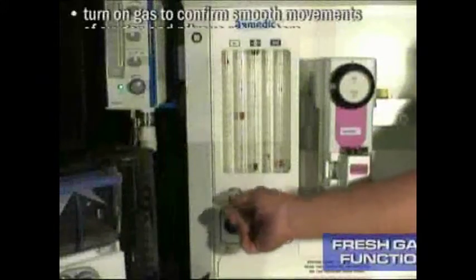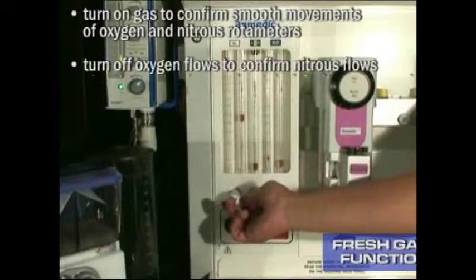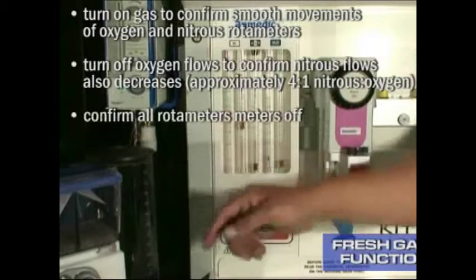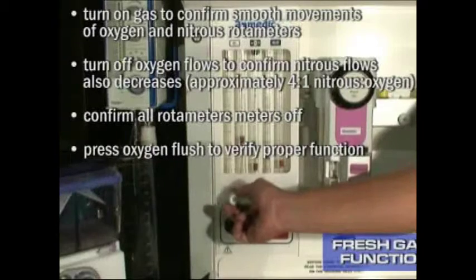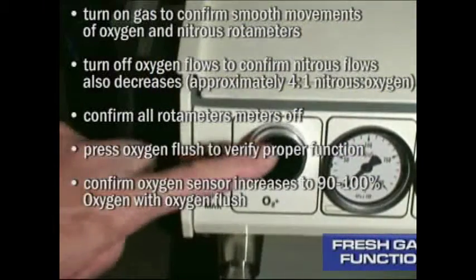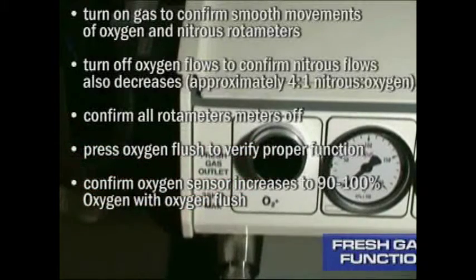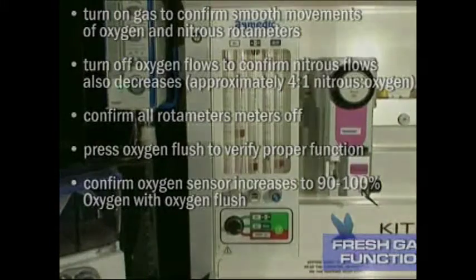Turn on gas to confirm smooth movements of oxygen and nitrous rotameters. Turn off oxygen flow to confirm nitrous flow also decreases, approximately 4 to 1 for nitrous to oxygen. Confirm all rotameters off. Press oxygen flush to verify proper function. Confirm oxygen sensor increases to 90 to 100% oxygen with oxygen flush.